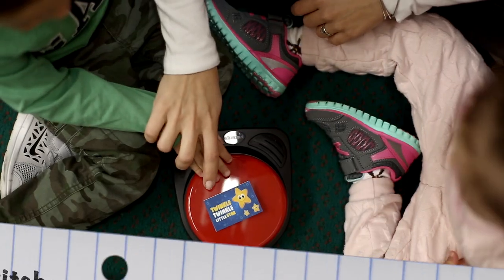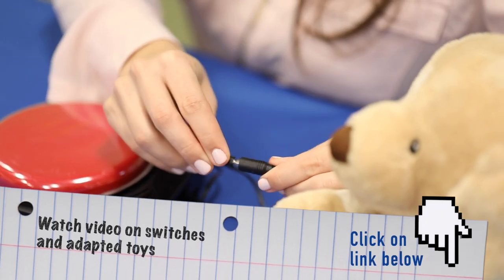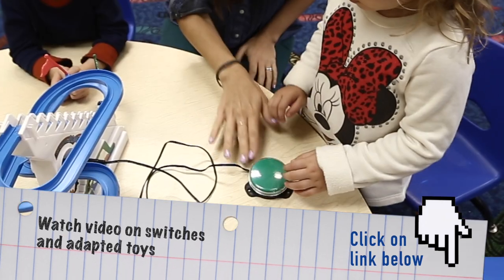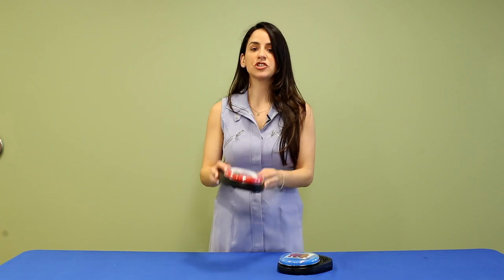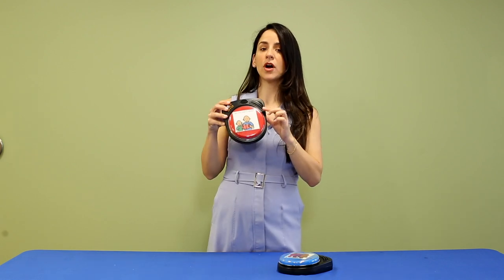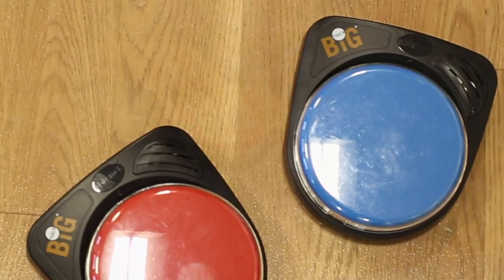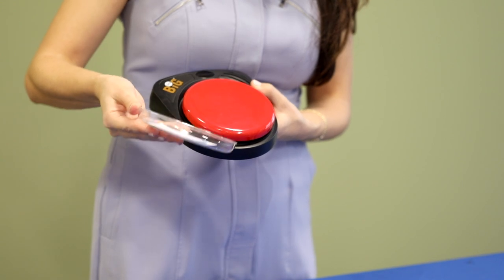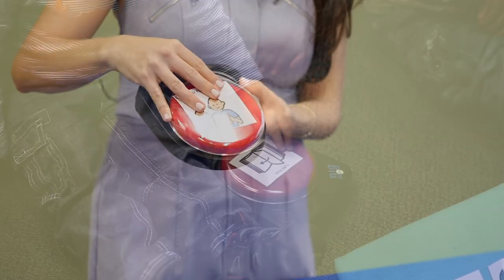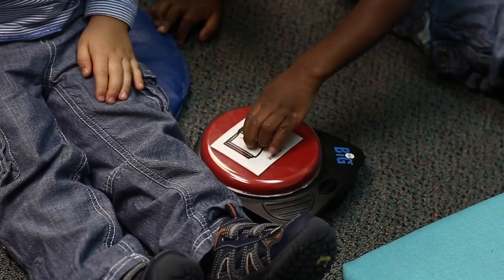The large button can also be used as a switch. We have linked our videos on switches in the bio below. The Big Mac features a large button that comes in several colors, and a removable clear plate to replace the image or visual symbols to match the messages that will be pre-recorded.